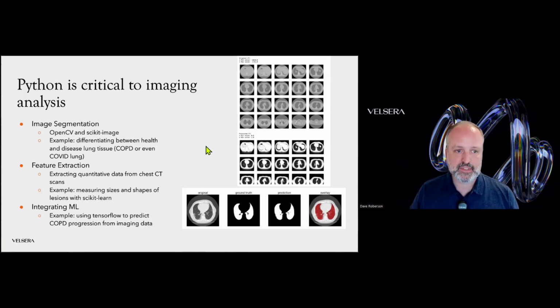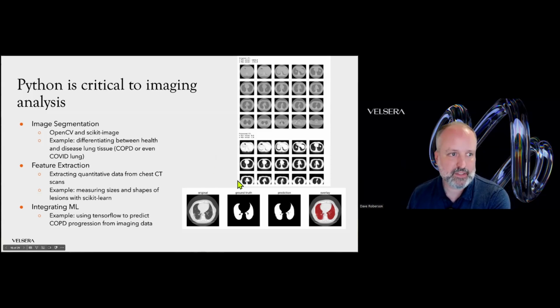This is one that we frequently use in a college level training that we give. It trains on open data, and you're able to segment and label where the lung tissue is in a CT image.